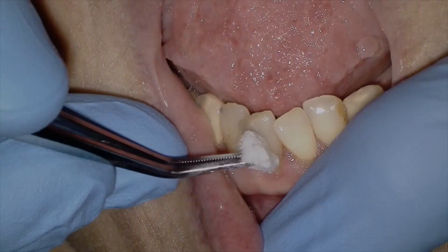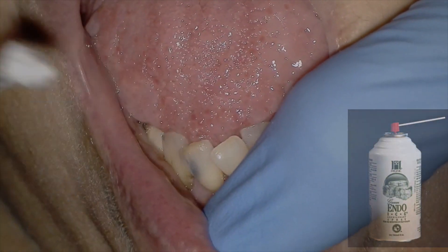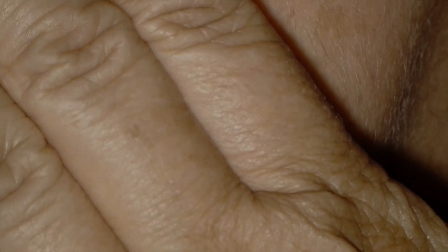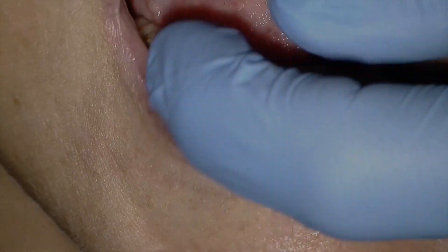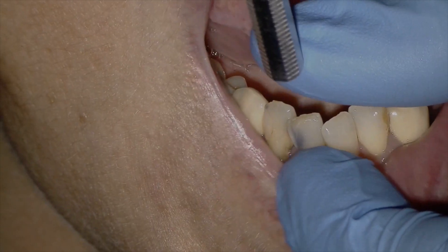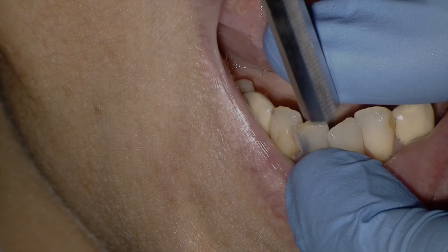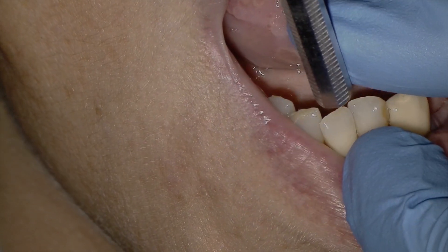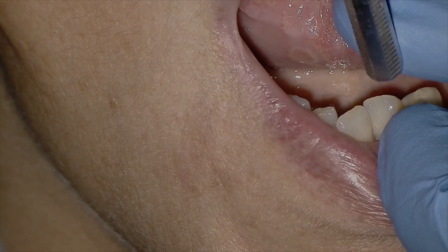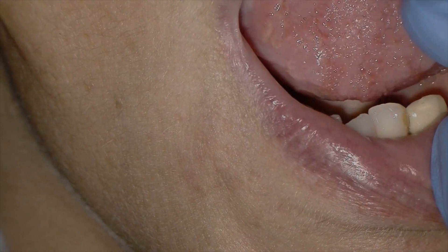This is a quick endo exam. Cold test is super critical, and this is an irreversibly inflamed tooth — ouch, that hurts. That's a perfect example of lingering cold, lingering pain to cold. I'll finish with a percussion test. You can see my left hand guiding the mirror handle so it doesn't slip off the tooth.